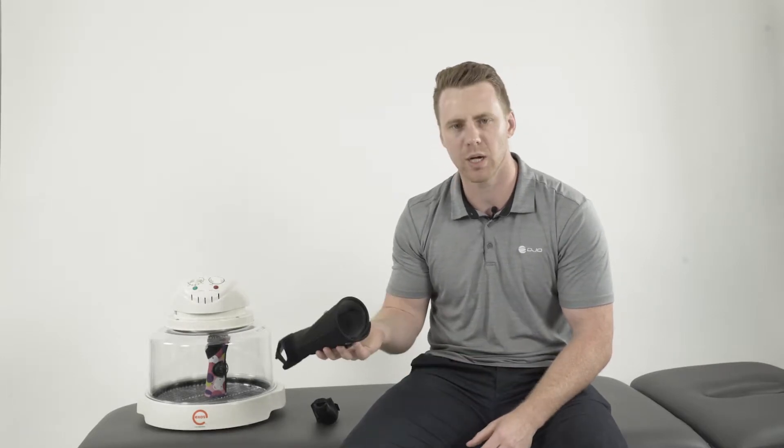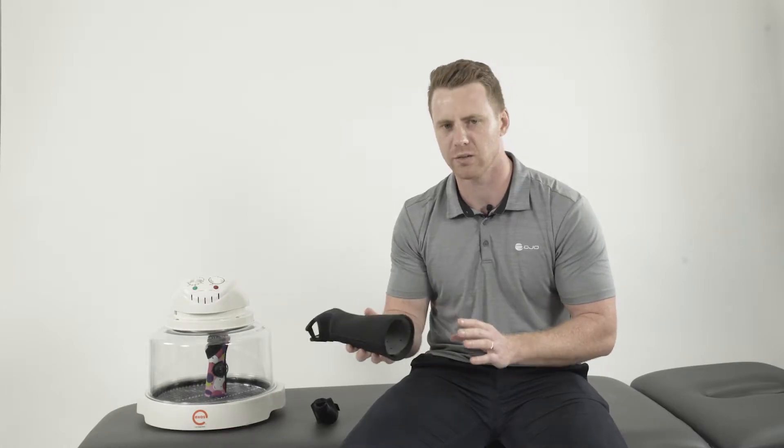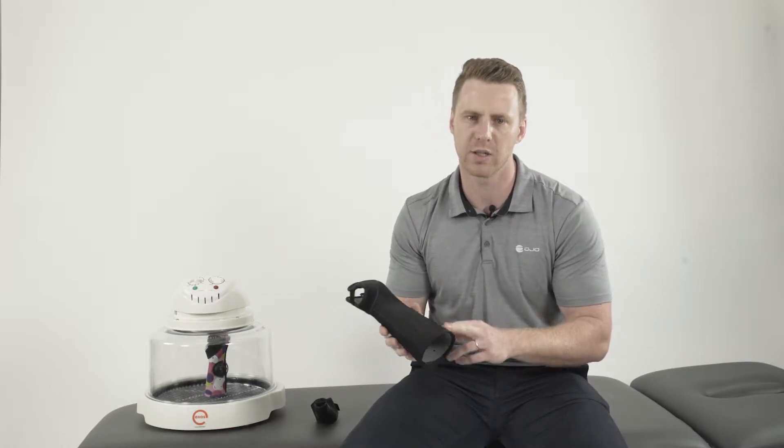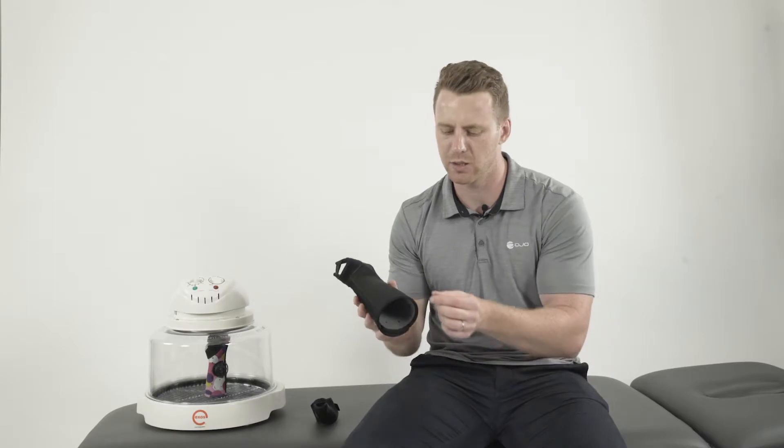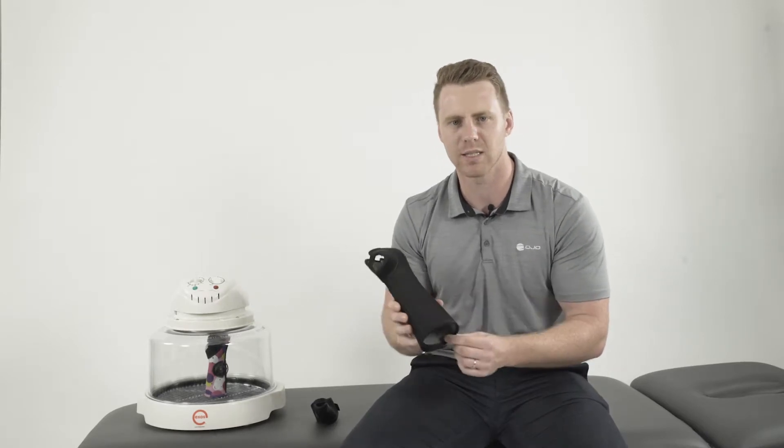The braces can be customized — if you have a wound site that you need to cut around, you have the ability to do that. You also have the ability to use the Exos finishing tape to cover up any exposed edges.